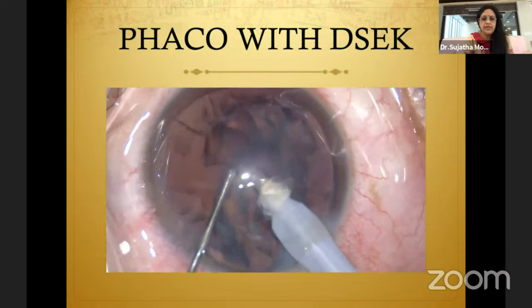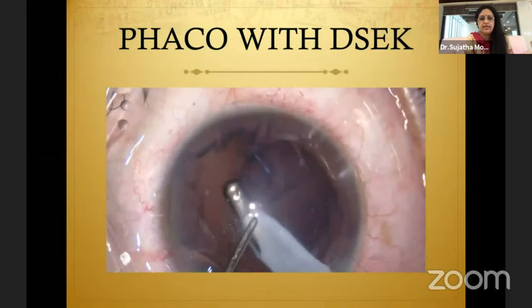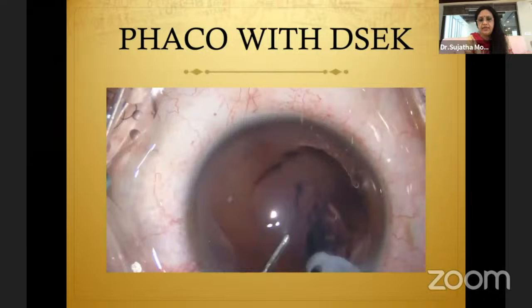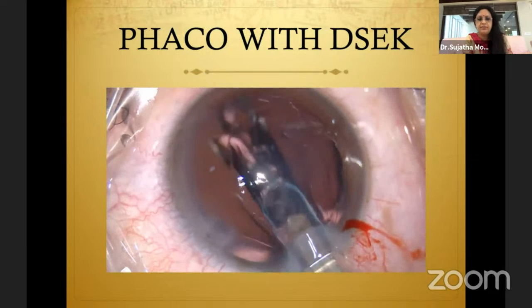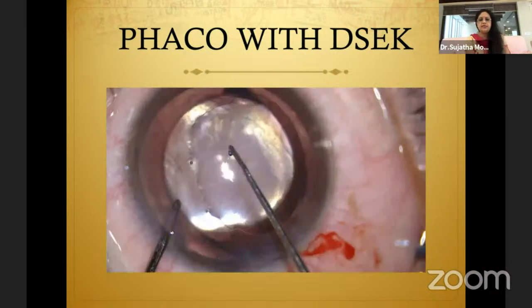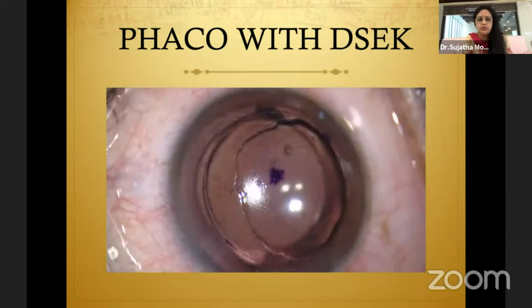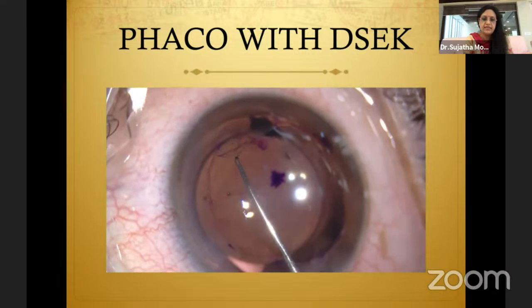So this cataract has come out very nicely. This is even in patients who have very early cataracts like this, probably grade 1, which you probably wouldn't be operating on. It's better to remove them because you don't want to go inside once the graft is in place, since you don't want any more endothelial cell loss. Unless the patient is very young and has an absolutely clear lens, then you can do a DSEK without removing the lens.